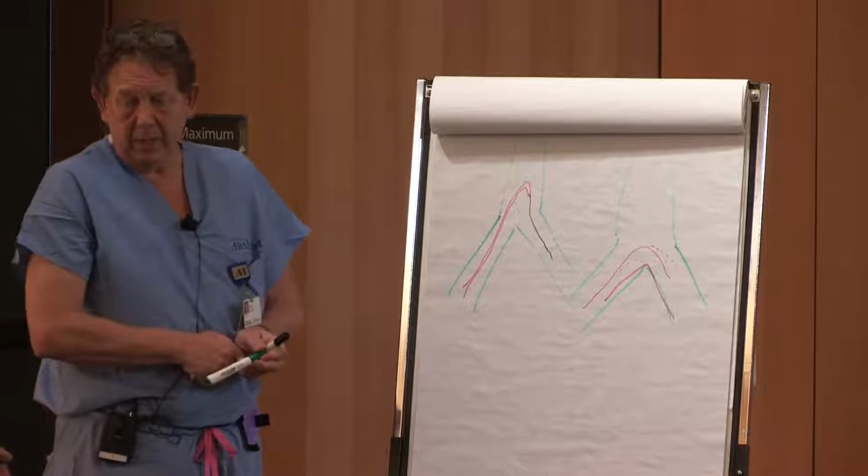It's hard to explain, honestly. What you're essentially doing when you're, quote, shortening the wire is leaving the wire tip in exactly the same location. If you keep the wire tip in the same spot and you pull the catheter down, well, it would advance, right? So you're having to withdraw the wire as you pull the catheter down to keep the wire tip in the same location. That's the tricky part of it.